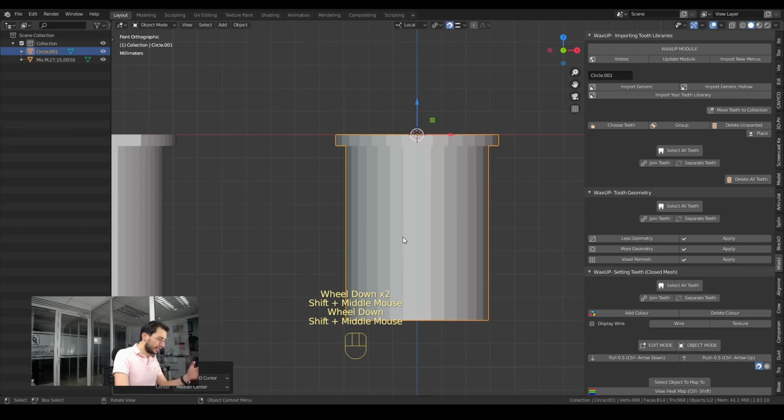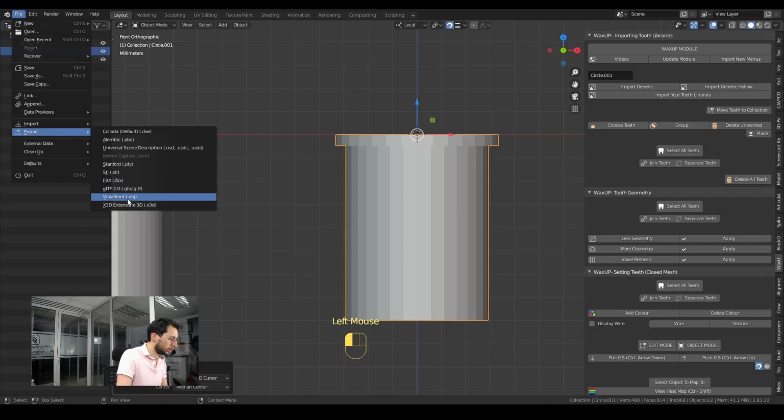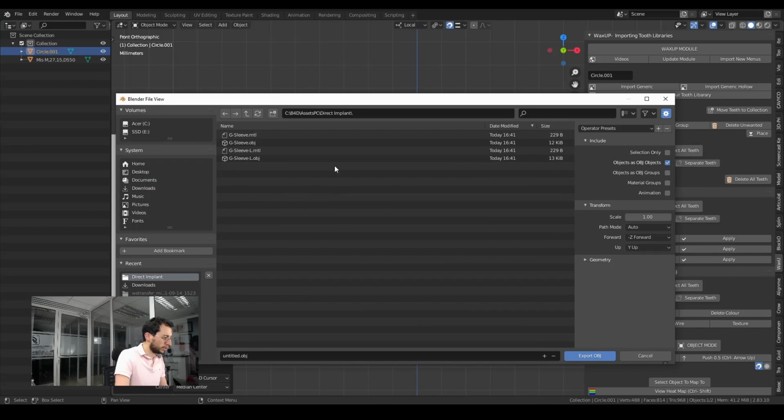That's it. Now I can export this element, but I have to export it as an OBJ file. I will save it in this folder, Direct Implant, which is under Assets PC, where I'm supposed to save all my assets for my component module. And this time I will type here YouTube. As you can see, I already have this cylinder's design, so I only will save this for demonstration purposes.